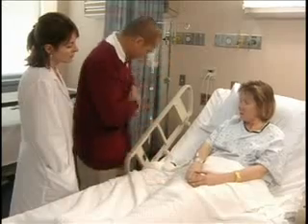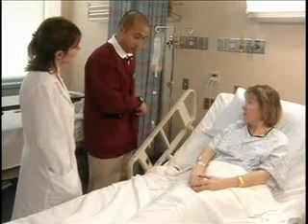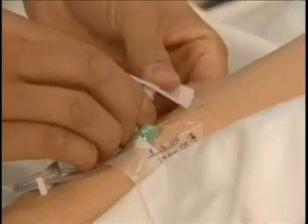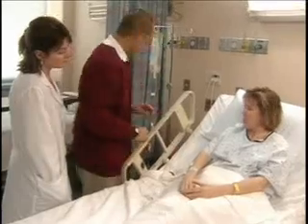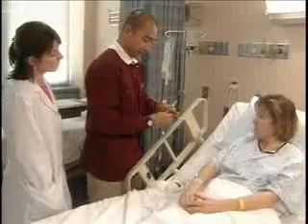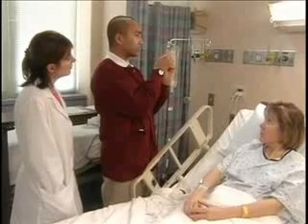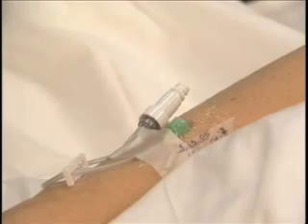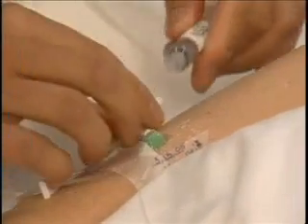Now I'll take an alcohol swab to cleanse the access cap, and I'll take a saline flush syringe. Make sure it's got no air bubbles, and I'll insert it in the access cap.